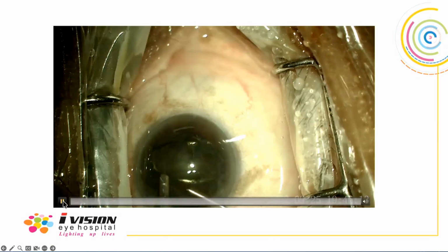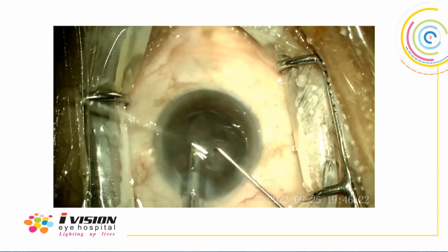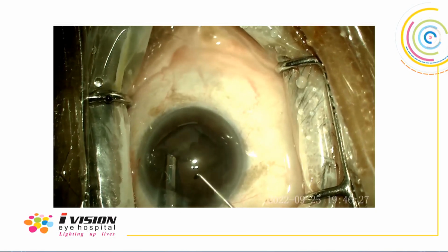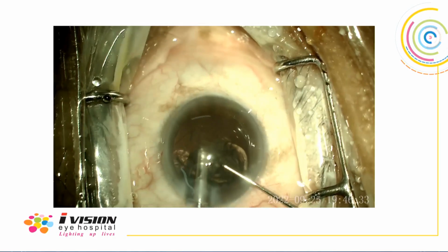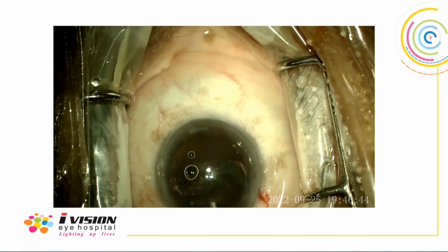This was a simple soft cataract. I finished the phacoemulsification, but I'm trying to take out the epinucleus by taking the probe to the periphery. Such overconfident acts can make you end up in major problems, like I ended up with a zonular dialysis.